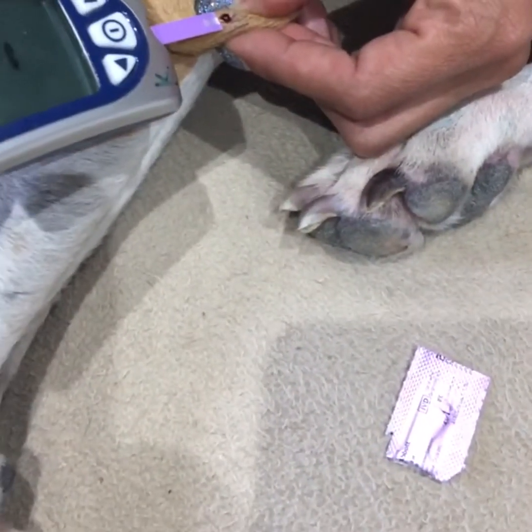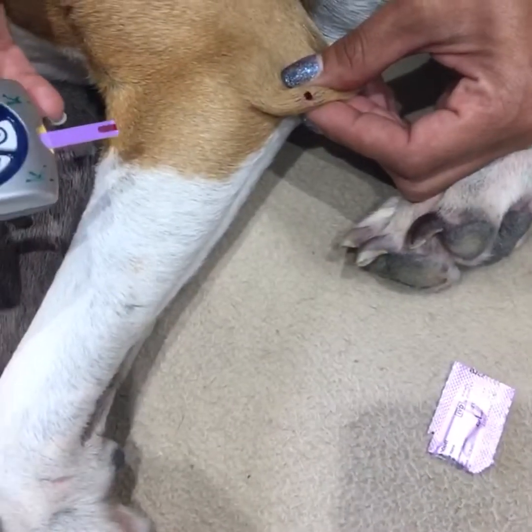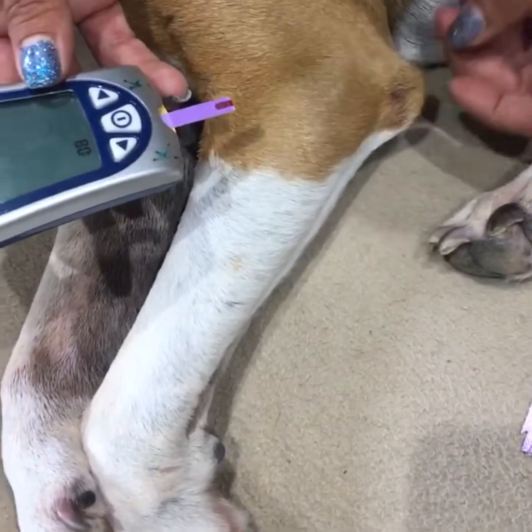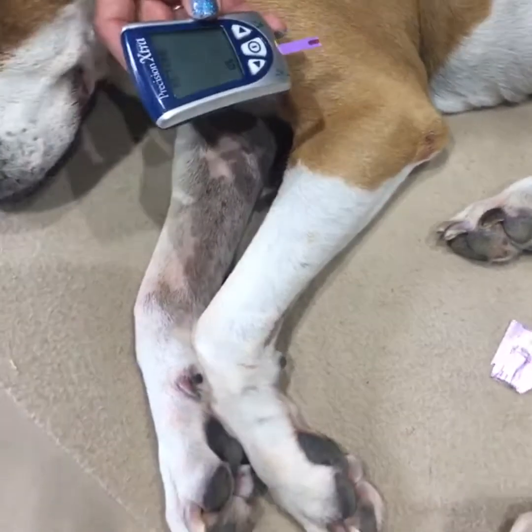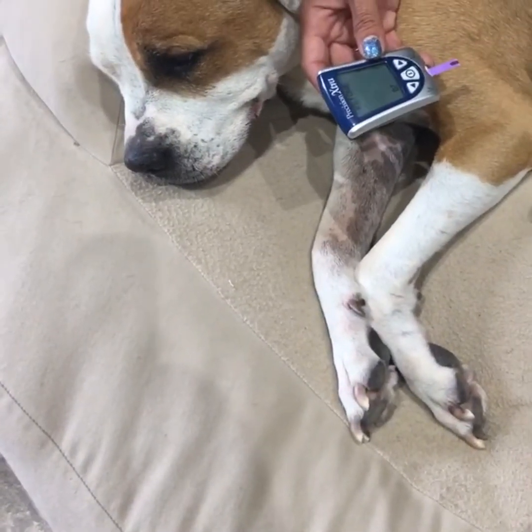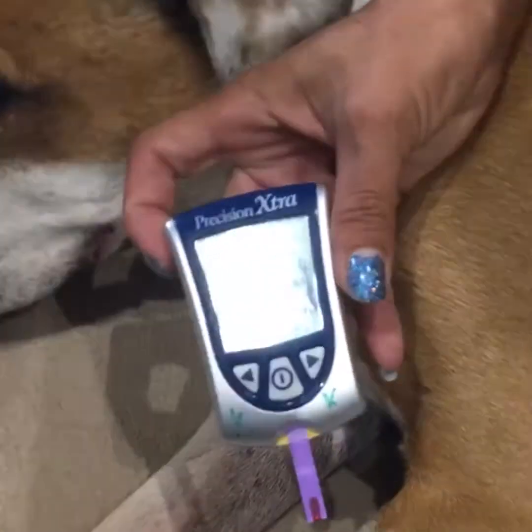Because most of them don't even feel it, you can do your ketone check there too — that's perfect. It's called a callus on a dog's elbow, just like a callus on a human elbow. Most of them don't even feel it.